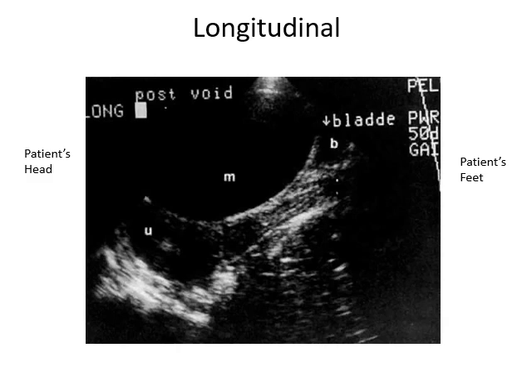Now make sure you know these. Longitudinal: head is on one side, feet are on the other side, because I always ask this. I always say, label on the diagram where the head and the feet are. All the time. People always get it wrong anyway, even though I tell you this is going to be a question. Okay, so that's the longitudinal way.